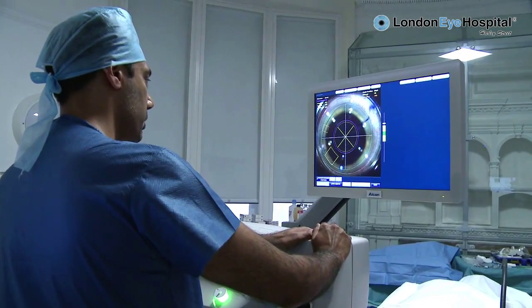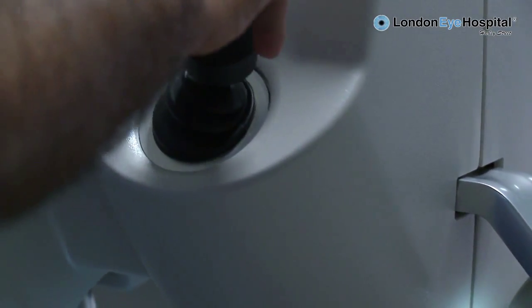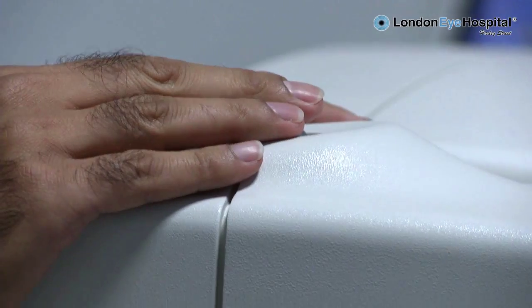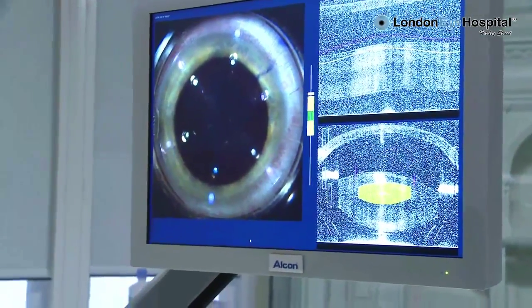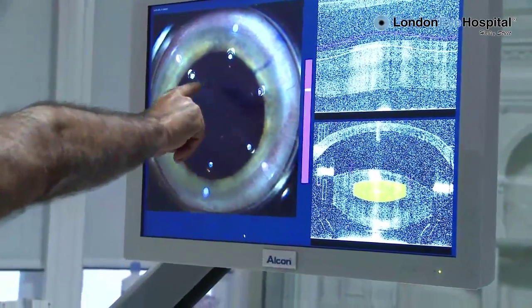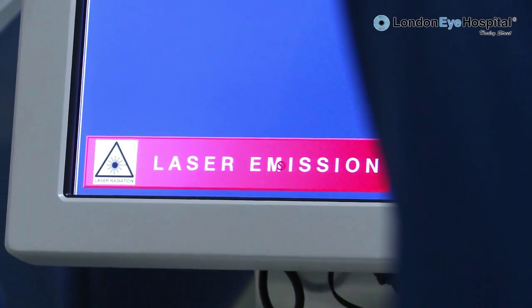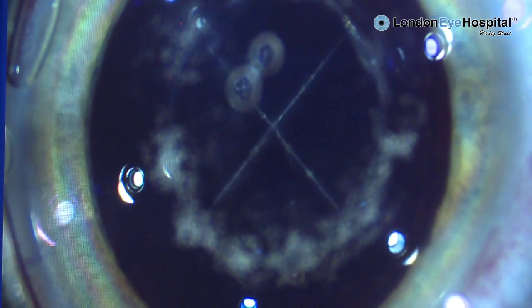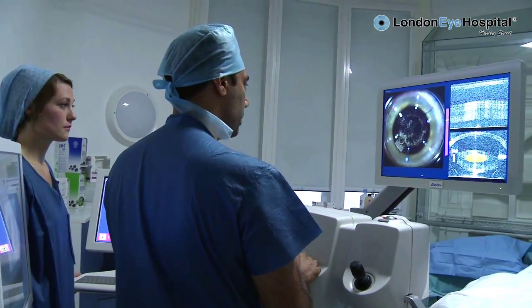So we then just program the computer for where we want to make the incisions. Just open both your eyes — it's come very close already, and as you already know, it doesn't hurt or anything like that. The laser is now creating an opening into the lens, or the cataract. Then it's going to break up the cataract into four pieces. And then it will actually make our incisions for us as well, without any needles or knives.